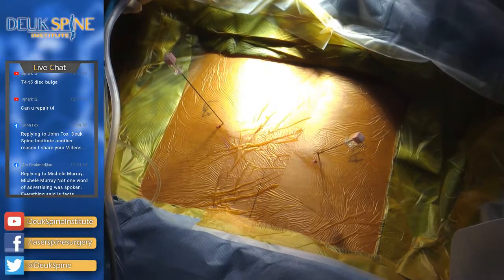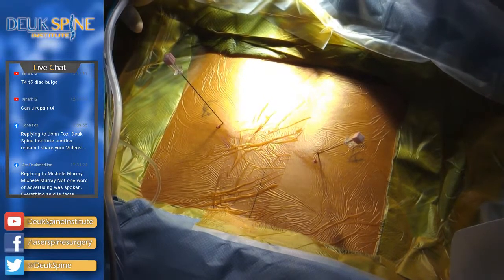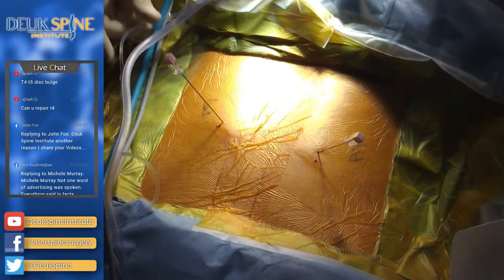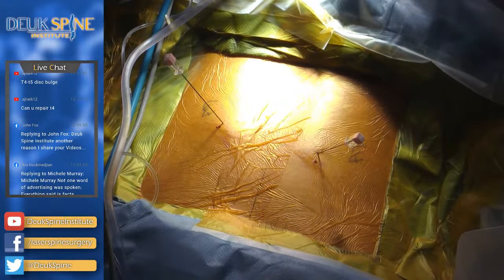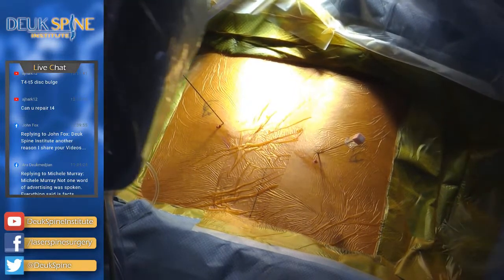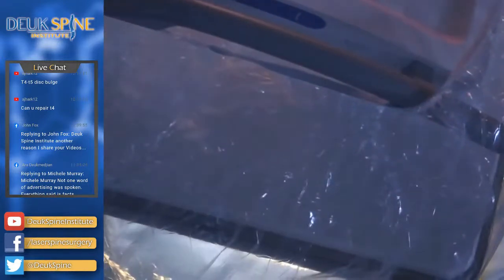All right, I'm happy with that trajectory. I'm happy with that view. Give me an AP. And we'll come back to that lateral in just a minute. So there's no guessing with the navigation because there's too many sensitive structures. We want to be as accurate as possible. We need to use reliable navigational information. And reliable navigational information comes from the proper tools to navigate.